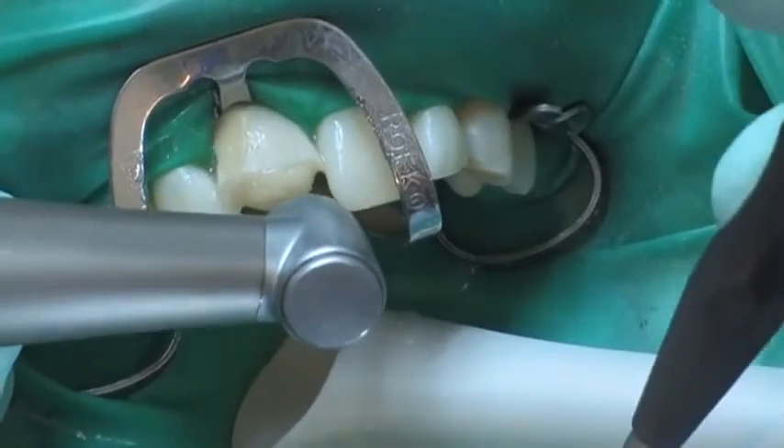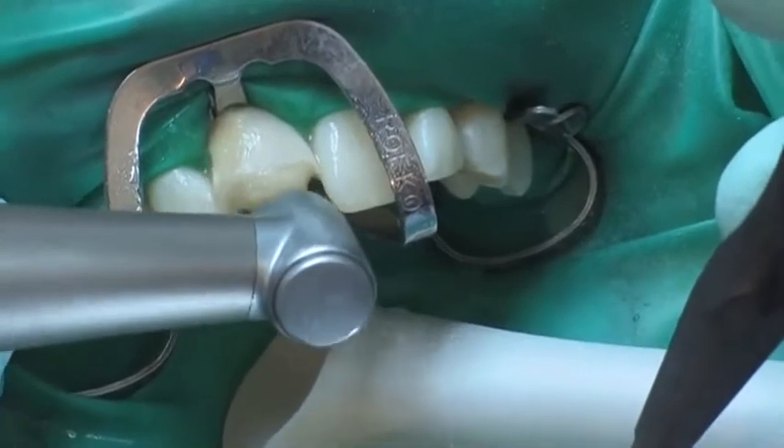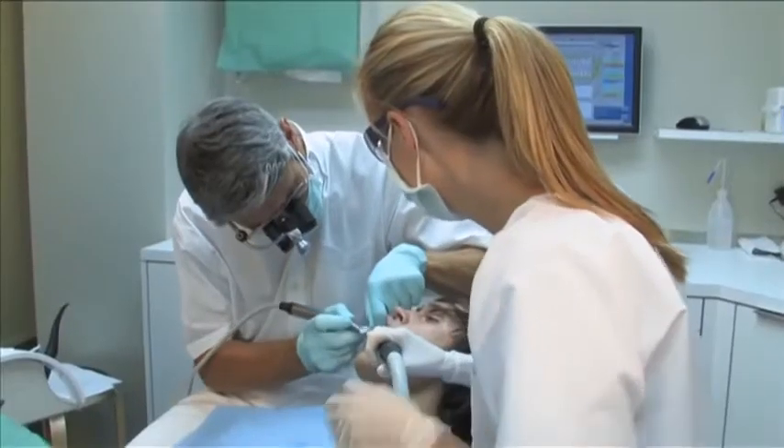The bulk crown preparation is performed using a 125 micrometer diamond instrument.